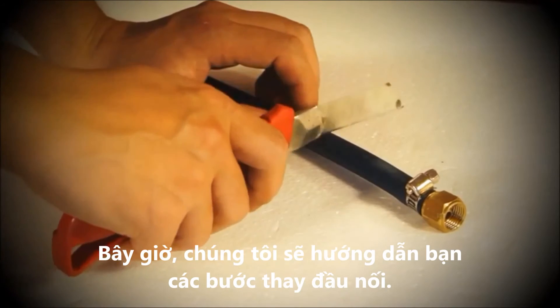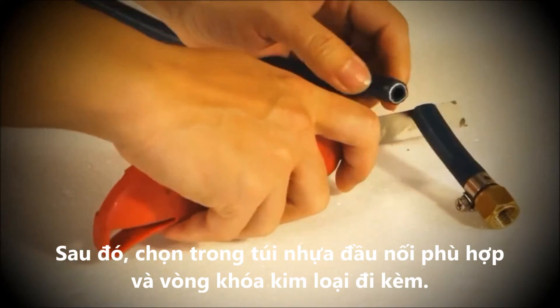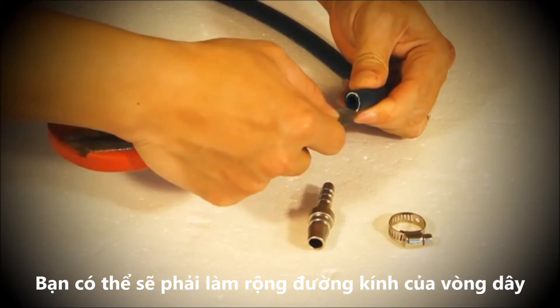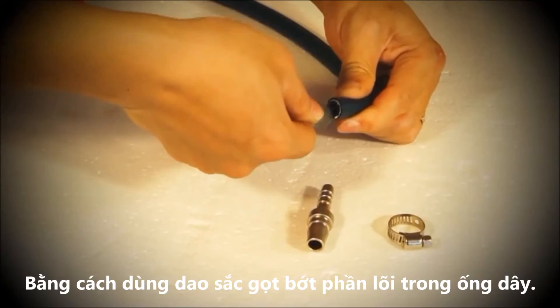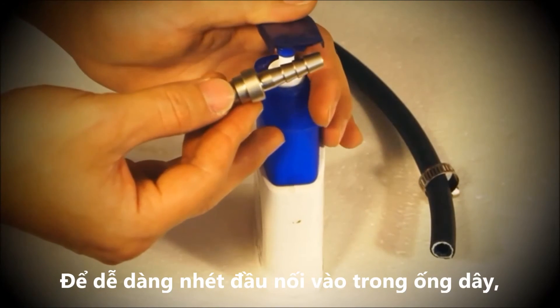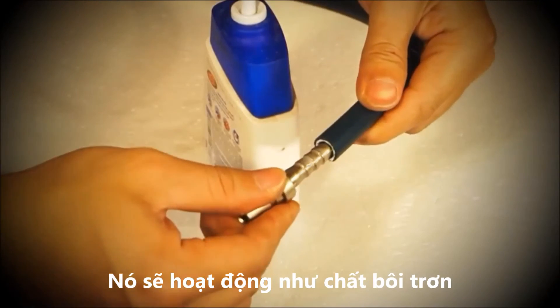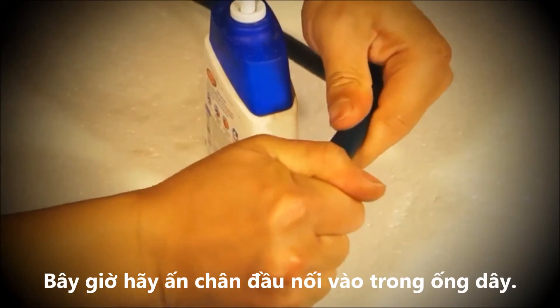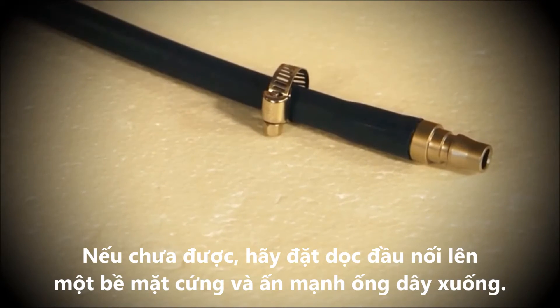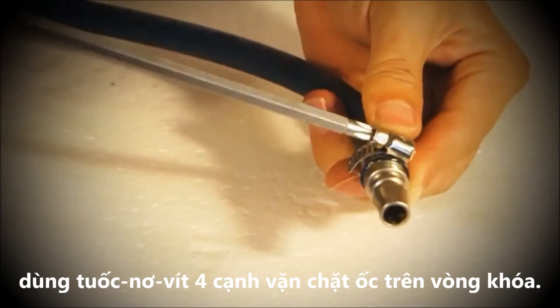Now we'll go over the steps to change the connector. First, use a sharp tool to cut off the end of the hose. Then remove the appropriate connector and the ring clamp from the plastic bag. You may need to use the sharp tool to enlarge the diameter of the hose slightly by cutting off the inside edge. Once the tube is ready, slide the ring clamp onto the hose. To make insertion easier, apply a small amount of hand soap to the connector as a lubricant. Now insert the connector into the hose — it will require some force. If needed, place the connector on a hard surface and push the tube onto it. Once in place, slide the ring clamp to the edge of the hose and use a Phillips head screwdriver to tighten the clamp.